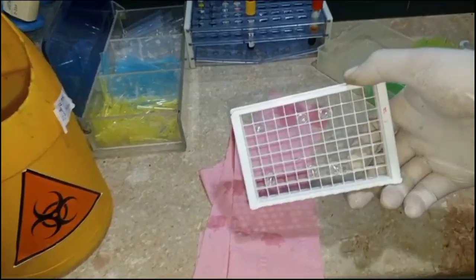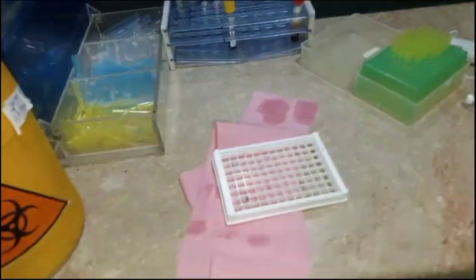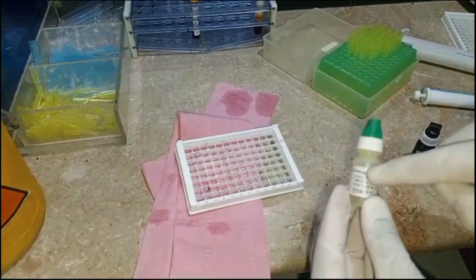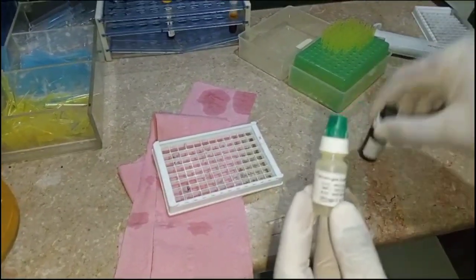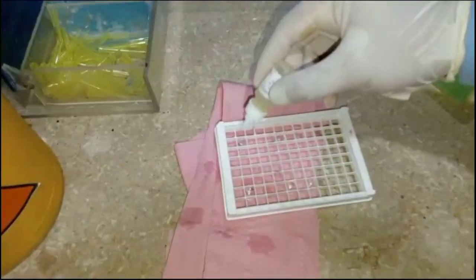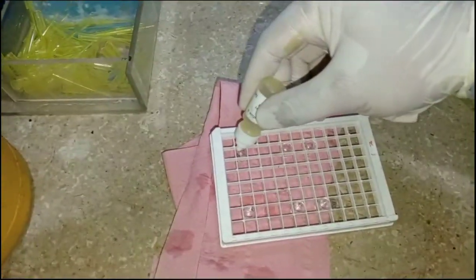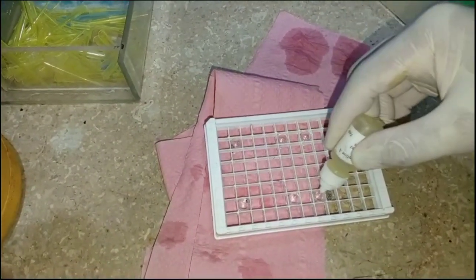As you can see, the wells are now dry. Next, what should we do? We have to add the chromogen solution. So first of all, we should add color A solution in all these wells, as you can see. Okay, so what is the purpose of color A? So color A, we can say, is TMB.